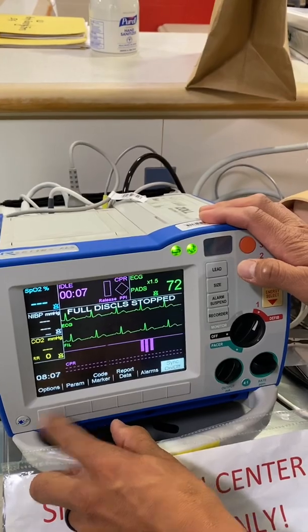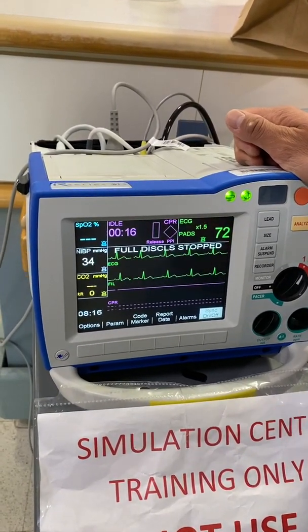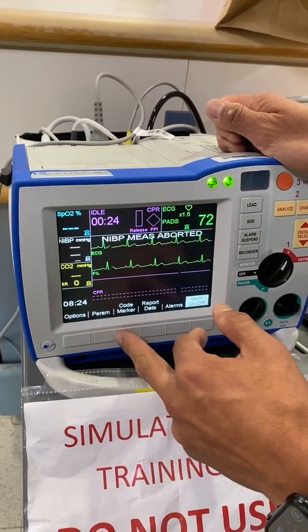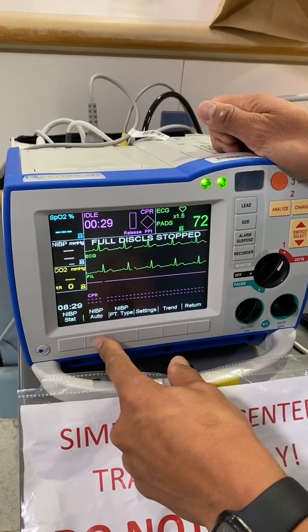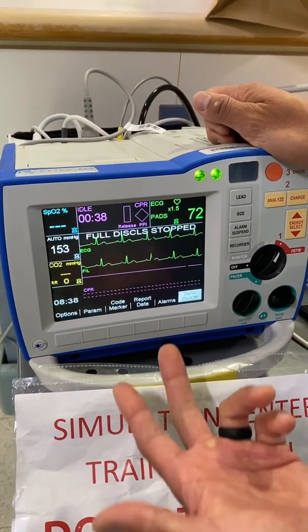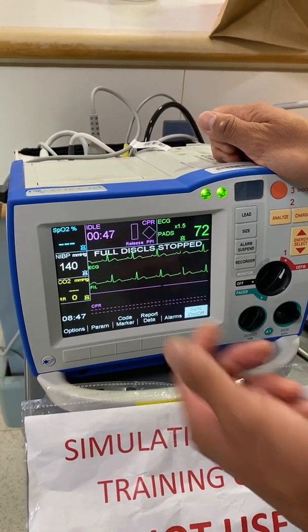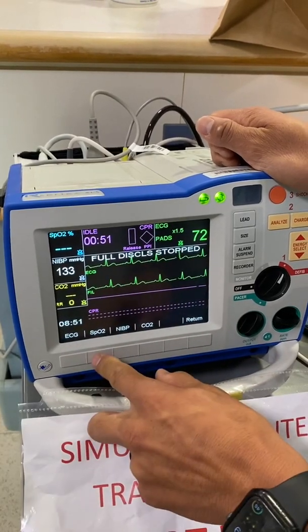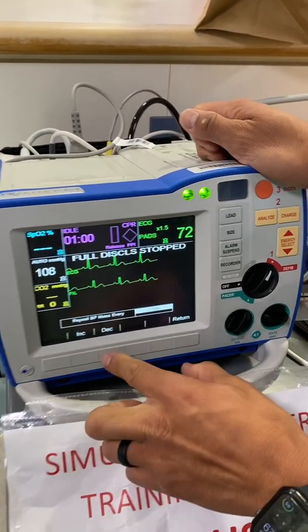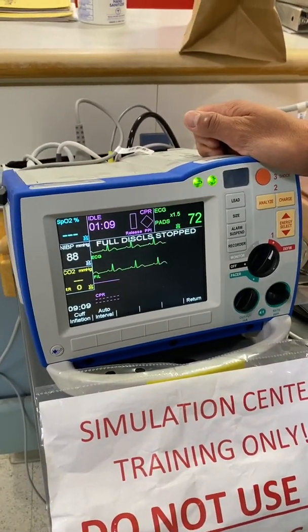Another thing to know: doing blood pressures. I want everyone to get in the habit — our other defibrillator didn't have this capability. Every time you press this button, you'll get a blood pressure. To turn it off, just hit that button. For automatic serial blood pressures, go to parameters, then NIBP, and press auto NIBP — it will go off on the default, which is every five minutes. If the team leader wants to change it, go to parameters, NIBP, settings, then auto interval. You can adjust it from two and a half minutes up to two hours — whatever's appropriate.